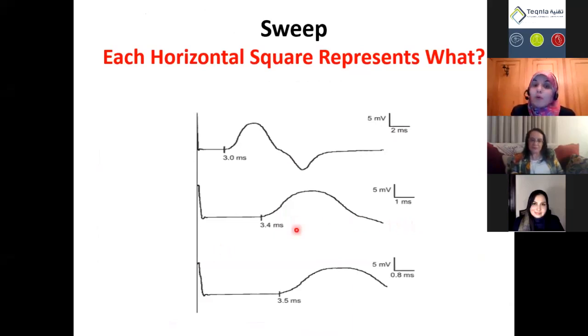When you see a broader response, the takeoff is different, which is the latency. You can measure a wrong latency due to the display problem by up to 0.5 millisecond, and we know in carpal tunnel the comparative tests differ by 0.5 milliseconds, so we cannot afford to have 0.5 millisecond error due to improper latency calculation.